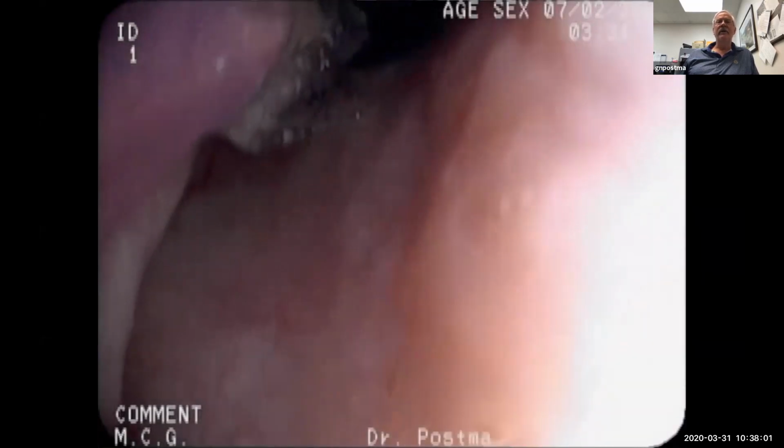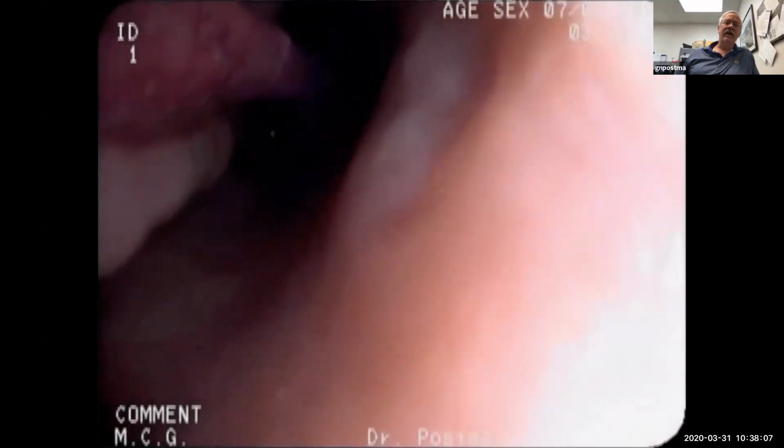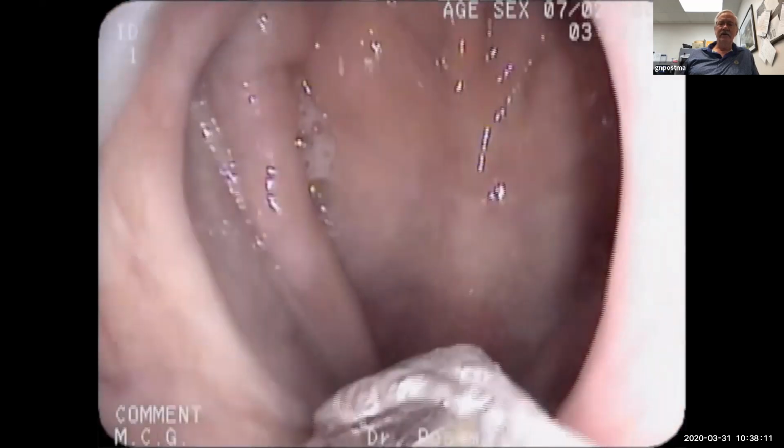I put that there like this. Our nurse accidentally checked the balloon. It inflated a little bit, then it's hard to crush it again. Never check these balloons. Never, ever check them. Put them down to the stricture and then inflate them. I left that there just as a reminder to explain that to people, because we screwed up.